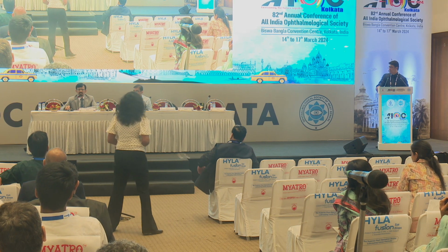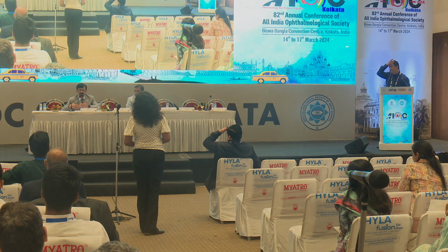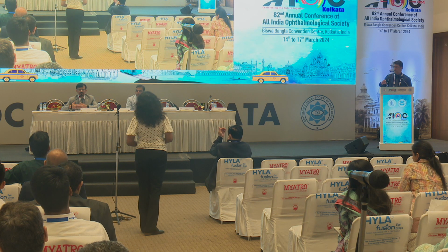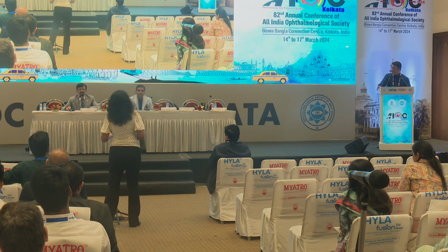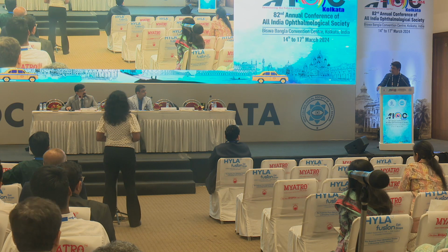Anything which is steeper than normal. I mean, if you consider 42.5 and 43.5 as normal, and suppose it's more than 44, if you have the femtosecond laser, why don't you use the femtosecond laser? I have done, I do up to 48 microkeratome LASIK without any problem. Actually, above.